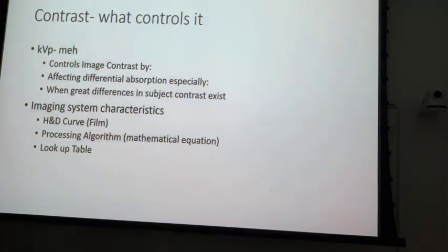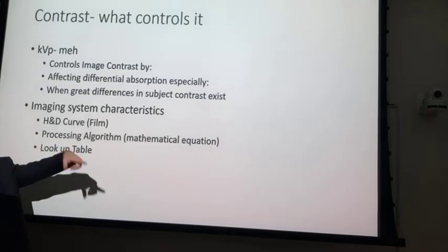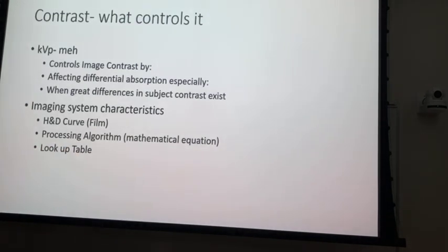It's a throwback to film and something we can make sense out of, that we can visually look at a lookup table and say, yeah, that's high contrast versus that. No, that's a low contrast. Okay.